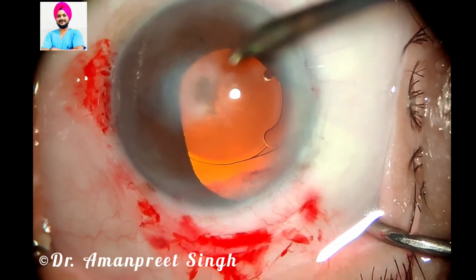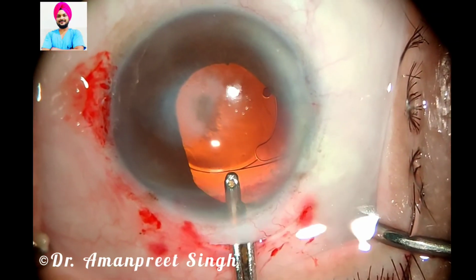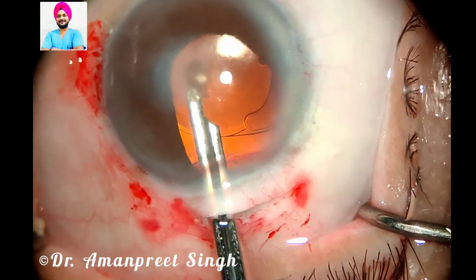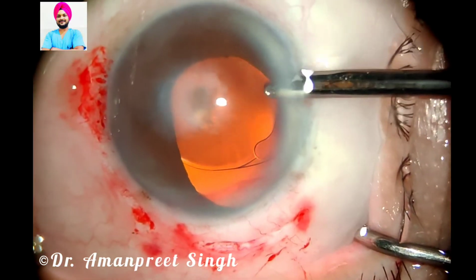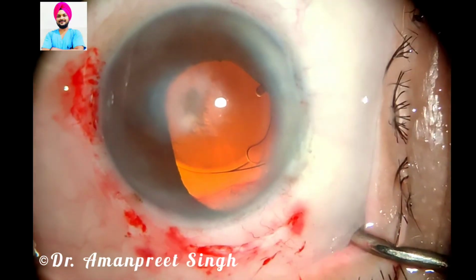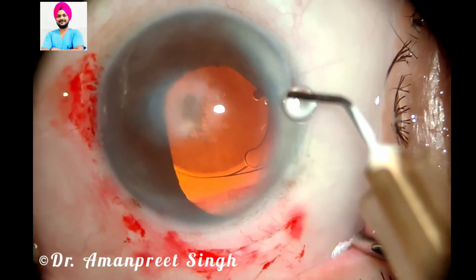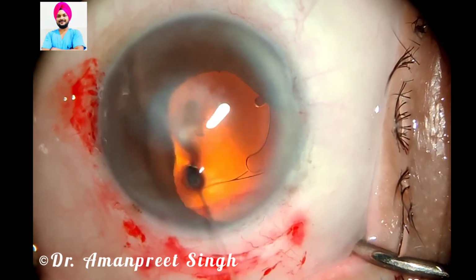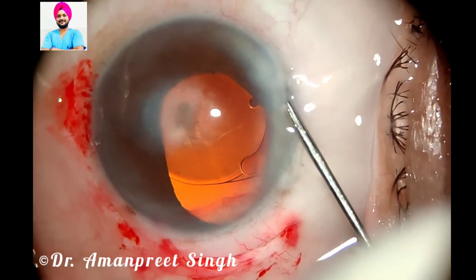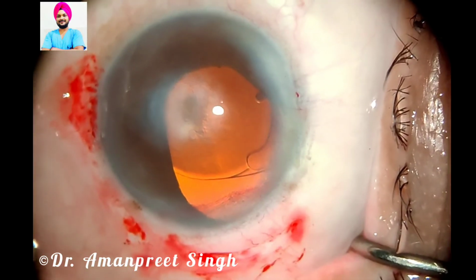You can see the iris is irregular, so what you can do is do a pupilloplasty, but as you can see patient is having a central corneal opacity, so doing pupilloplasty in such a case is not a very good idea. So I didn't do any pupilloplasty. Here is the intracameral moxifloxacin, and now I am hydrating the side port, and that's it. We have completed the case. Thank you so much.